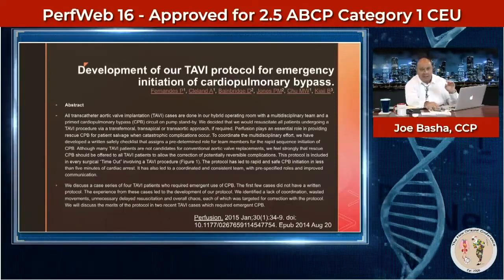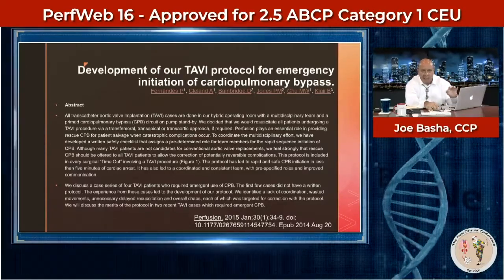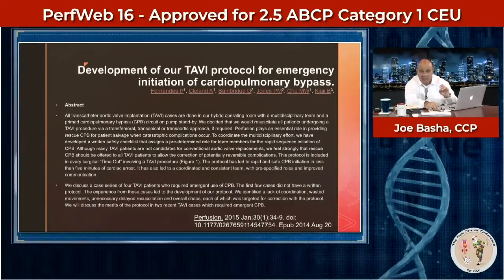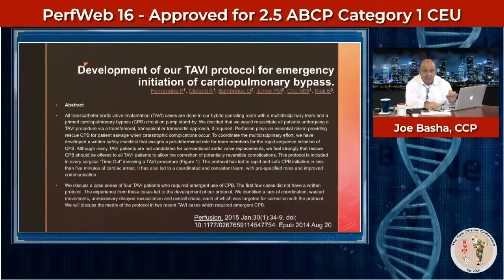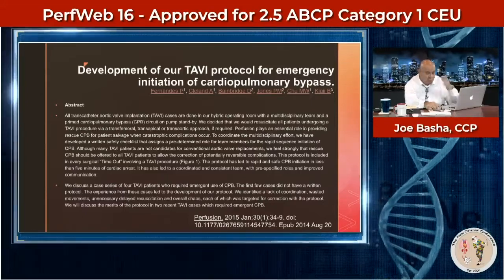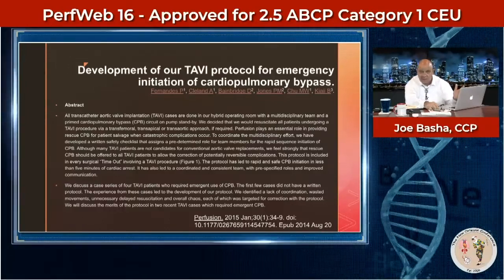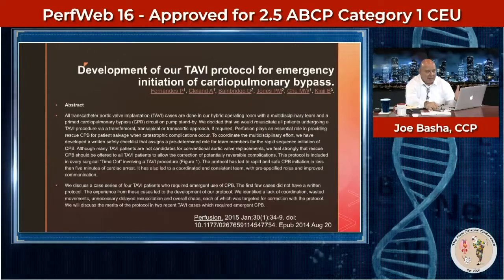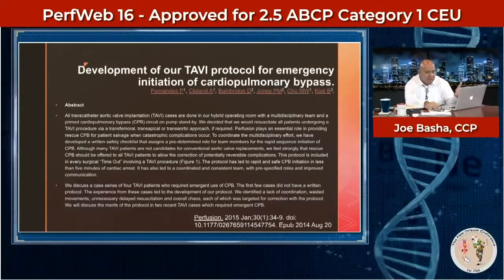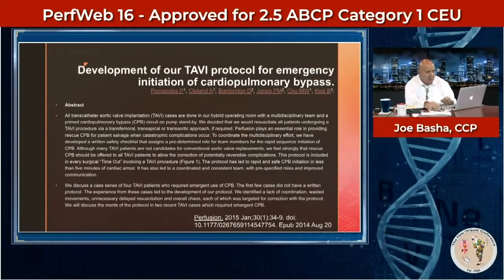Now look, that was a whole lot of verbiage, but what they're saying is they have the pump in the room, primed, and a perfusionist on standby actually as part of the team that's performing the procedure. And even with that, it takes 5 minutes, and if the patient, of course, is in VFib, then they're being resuscitated for those 5 minutes. Hopefully the resuscitation is good or the CPR is effective, but that still takes 5 minutes. And I think that's probably being pretty generous to themselves, at least that's my thought, because I've been in these circumstances before, as many of you also have.